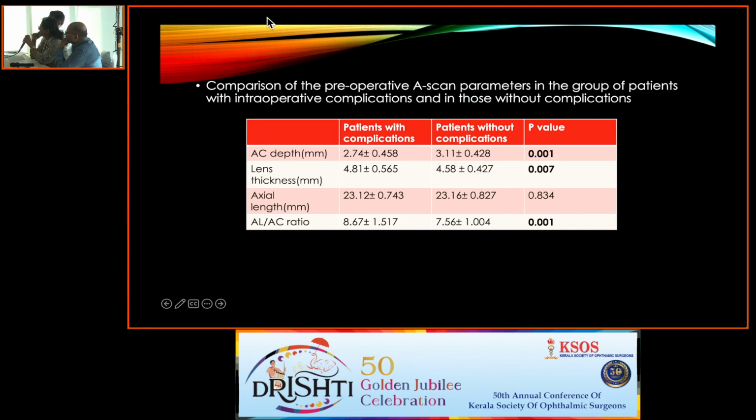Anterior movement of the lens. Axial length by AC ratio, you could do a lens vault study. What can actually happen is that anterior lens vault. Yes. ASOCT, you could have done this. Nevertheless, it's okay. You have done whatever is there, right? Then you have to buy another machine. That's difficult. But what it actually reflects is your anterior lens vault.